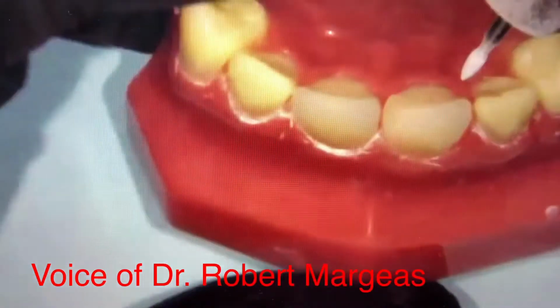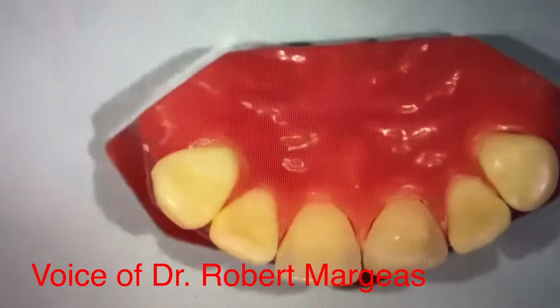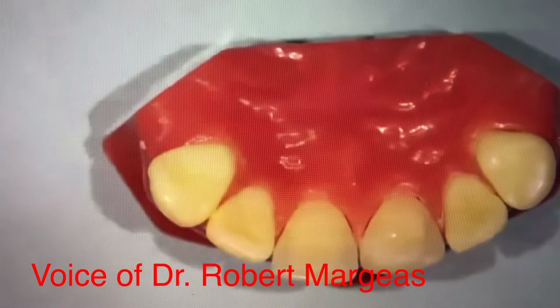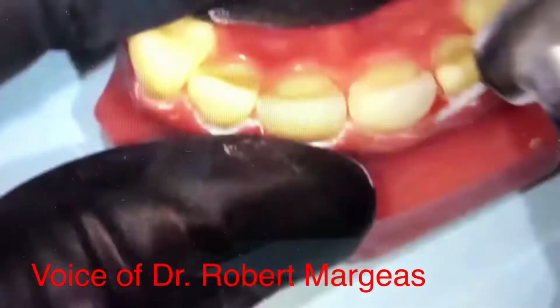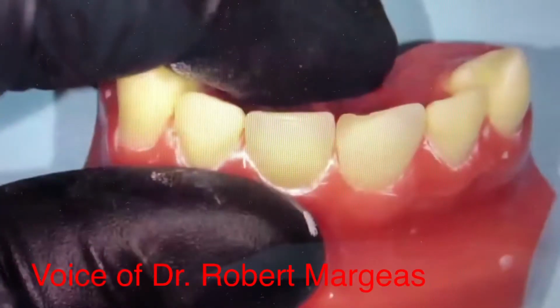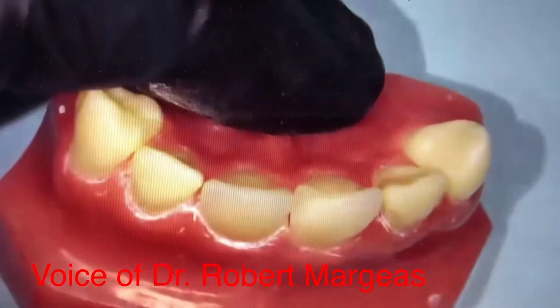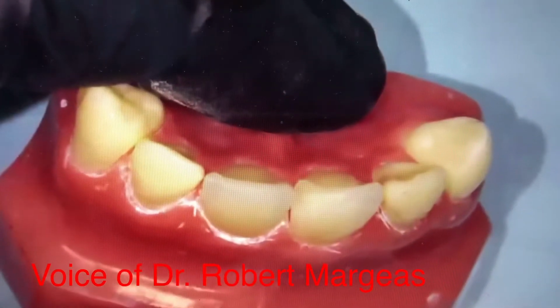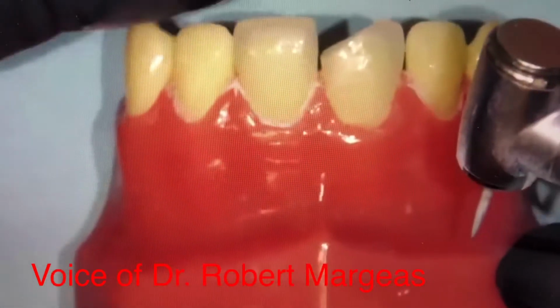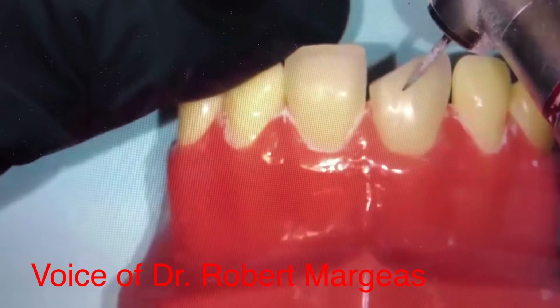Now, you can see here, let me get the other diamond. You can see where the DEJ happens to be on this tooth, right here, the dentin enamel junction. Now, I don't want to expose the dentin, but I want to be very, very close to the dentin where that fracture line is. Why? I want to be able to place the material on here, but still have room for my enamel.